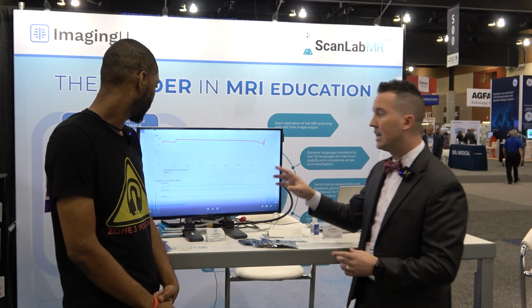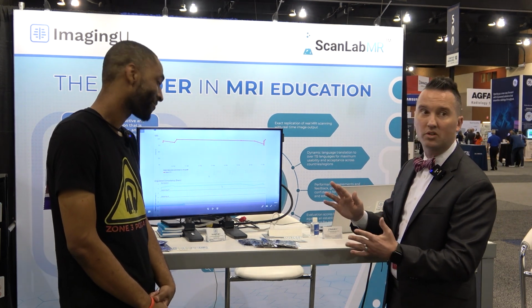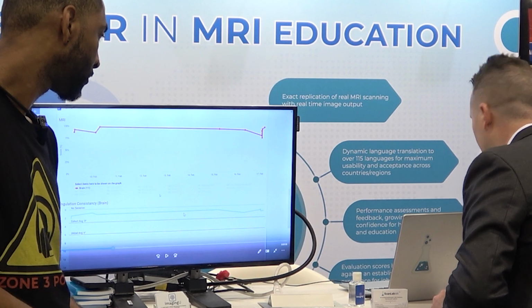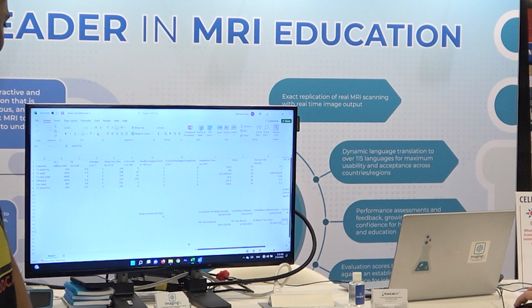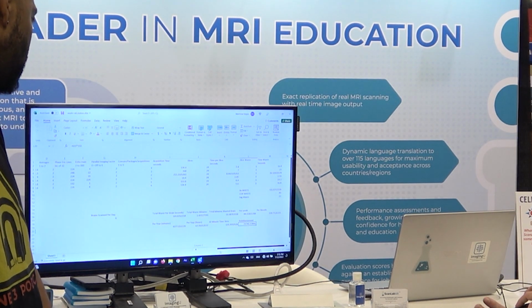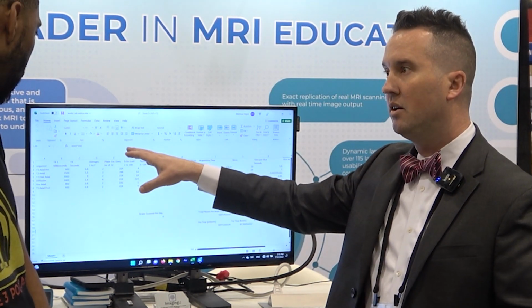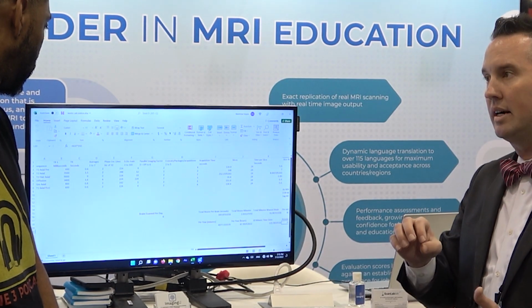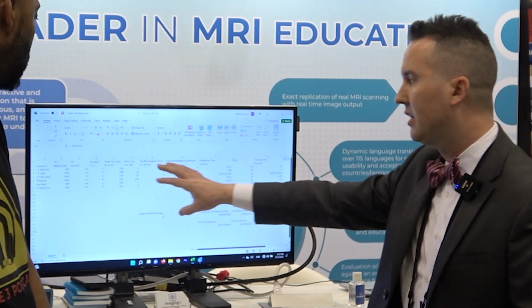Right. So let's say this person, and this is nuts, overscans by 3 slices for every axial brain. Okay. And everybody's like, oh, that's no big deal. And you're like, yeah, 3 slices, huh? So what we can do now, and this is a manual process right now, is we get the TRs, we get the averages, we get everything that has anything to do with time. In the very near future, you will be able to see everything that affects time.